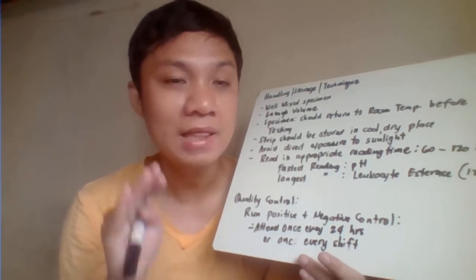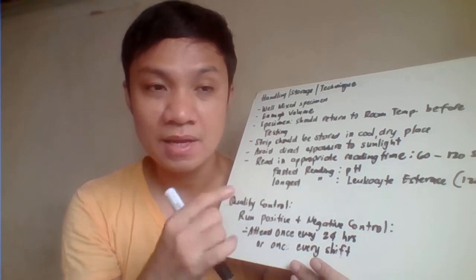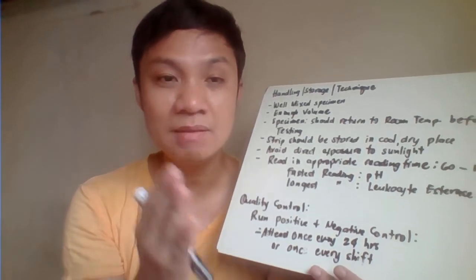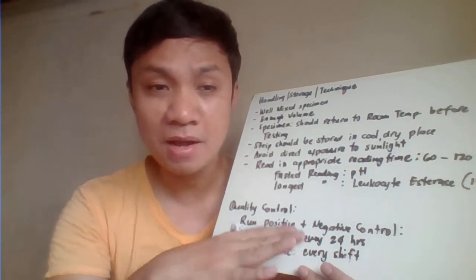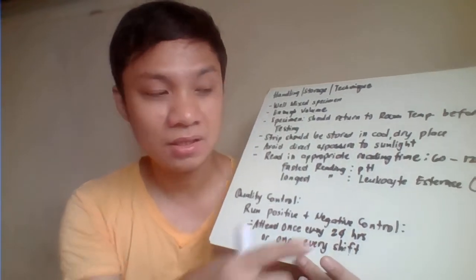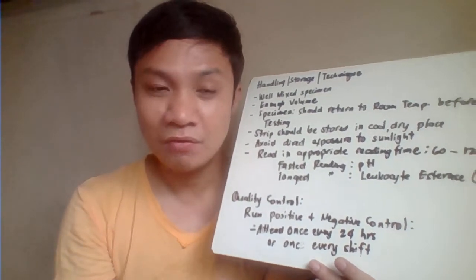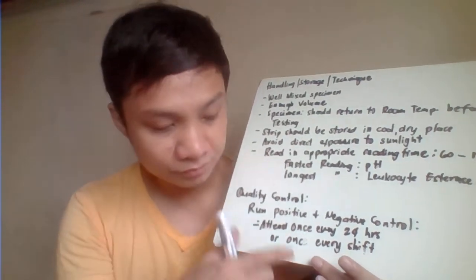Only that distilled water is not a recommended negative control because again, your reagent strips have been manufactured to react with a substance similar to our urine sample in its composition, not distilled water, because distilled water has no ions. But considering the result, distilled water would have a negative result. But then, of course, distilled water is not the recommended negative control solution.